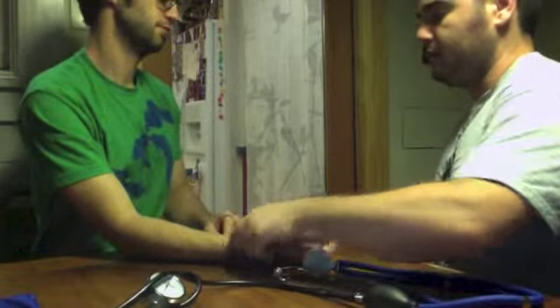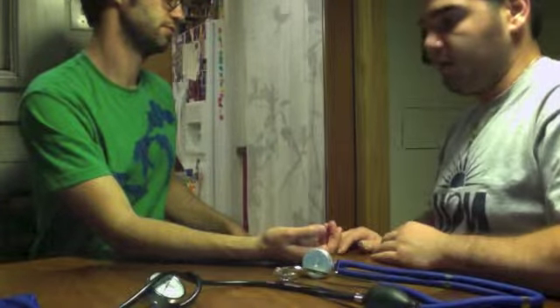Okay. So first, I'm going to have the patient sit up straight, legs not crossed, in an upright position. I'm going to have him take his arm and just place it gently on the table. Normally we would have his arm at his heart level, but we have a few inches off, and I think that'll be okay to distinguish his blood pressure.